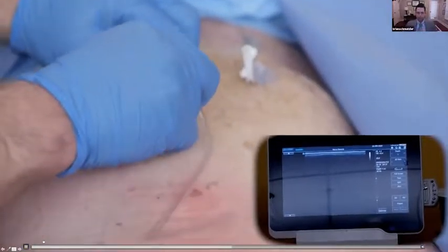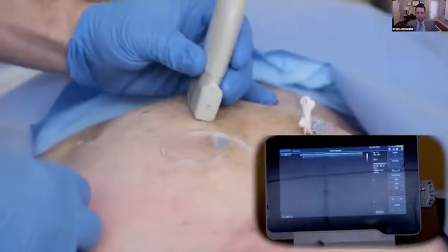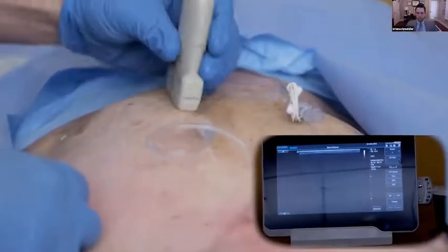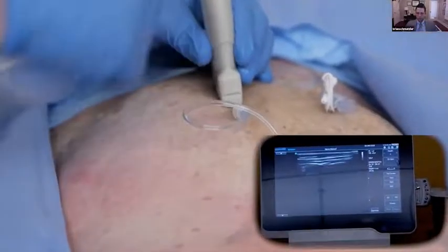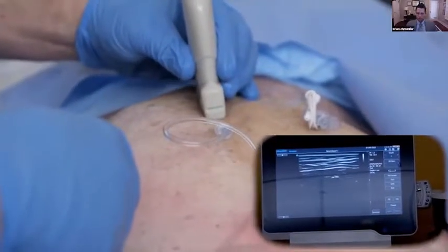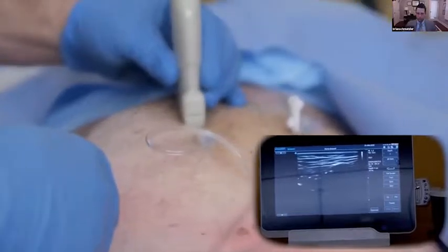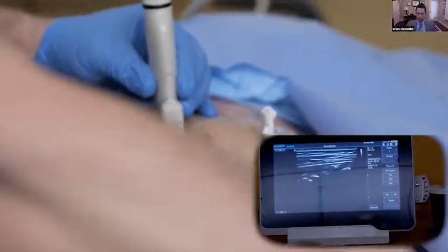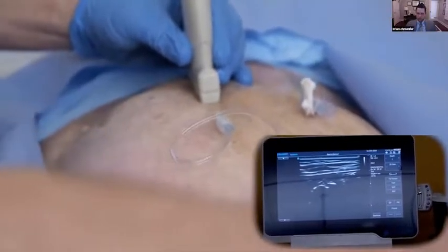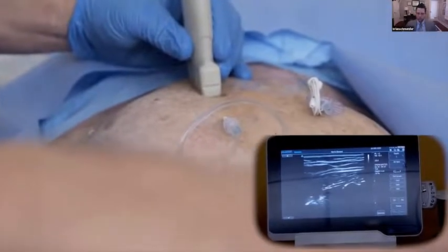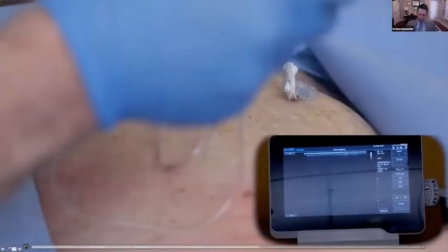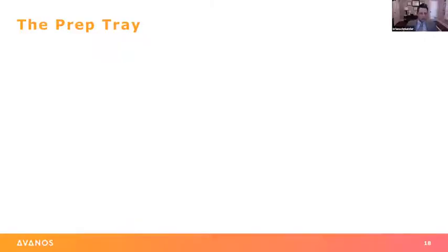What's really nice about these catheters is that they're pretty echogenic. You can actually see the catheter coming in. I'll just follow that catheter in, inject a little bit more, and there's the TP we were at before — up a little bit higher. You can see the catheter there, pushing that muscle right up. Hopefully that gave you a nice representation of how we actually do these blocks.